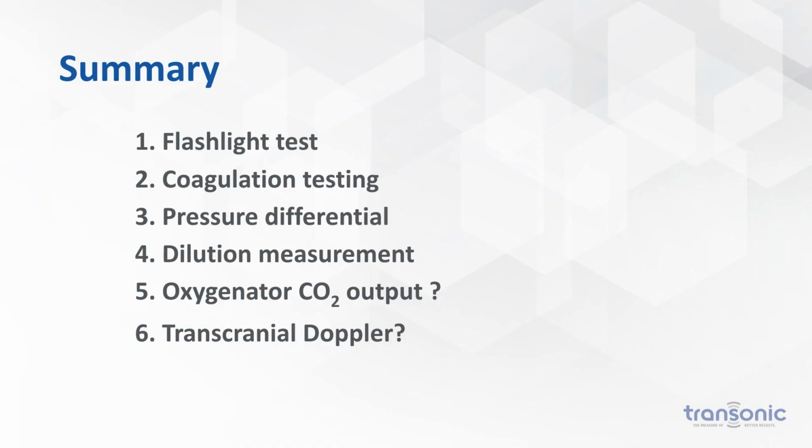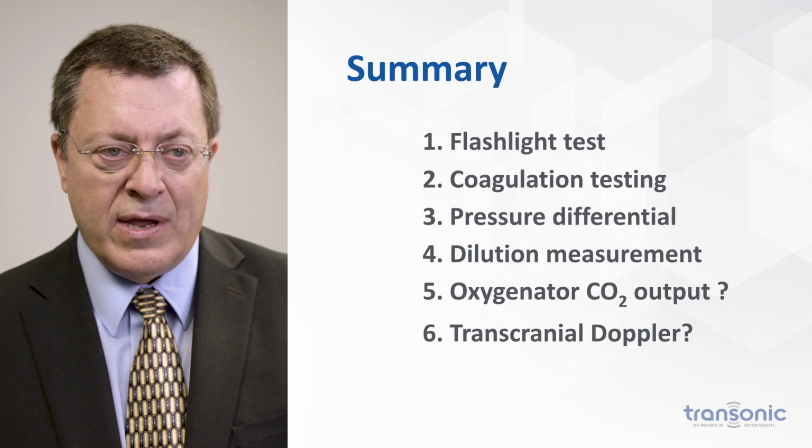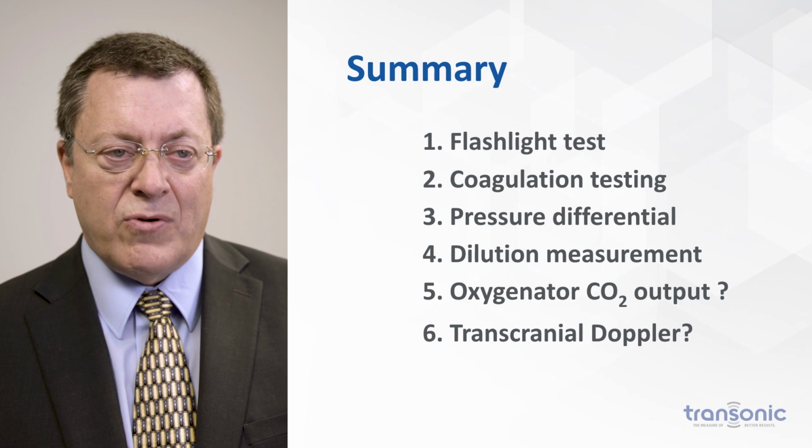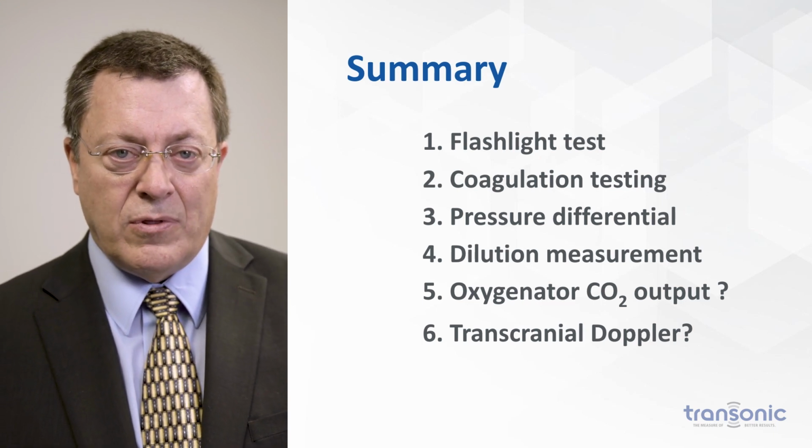So those are the basic things we're using now and hopefully will be using. To give us an idea, we have the flashlight test, the coagulation testing, pressure differential, and all that we now know about that. The dilution measurement that is available now, and the oxygenator CO2 output, time will tell. We don't know how that'll shape up. And the transcranial Doppler, which is taking care of the brain, which is something we're all looking at more and more.